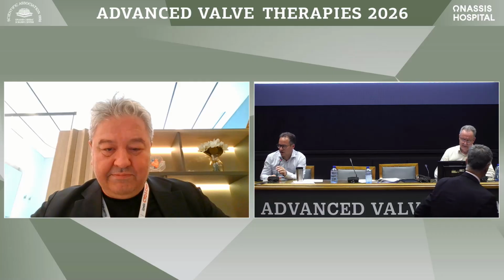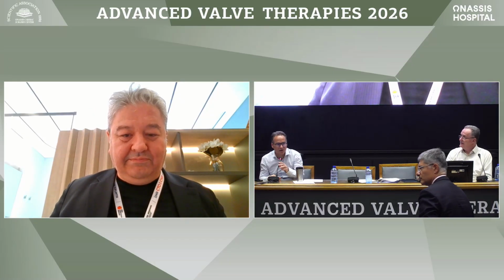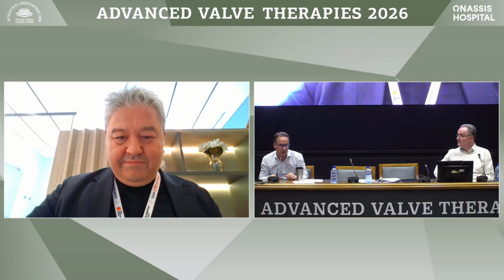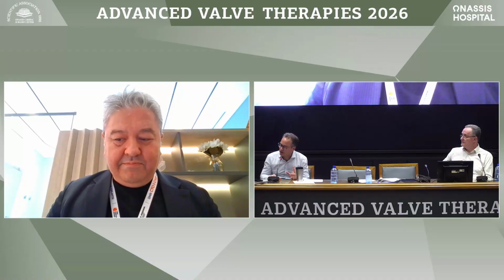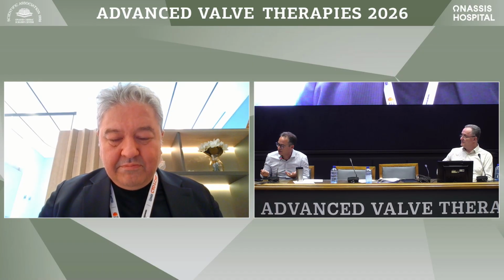Thank you very much. That was fantastic. I'm interested in this question I asked before. Yannis, do you ever use this Terumo wire through the metallic valve? Is there any issue with that? We have crossed a few times, but to do a loop, is this okay? So this loop through the metallic valve, how does it work? Because you use the loop to pull something, so you would just make the valve fully open. How do you do that?